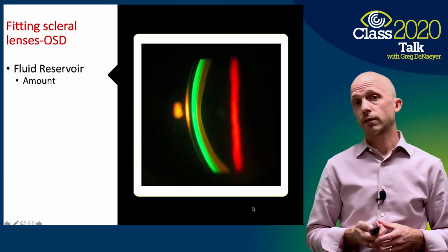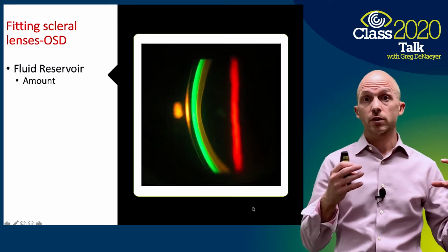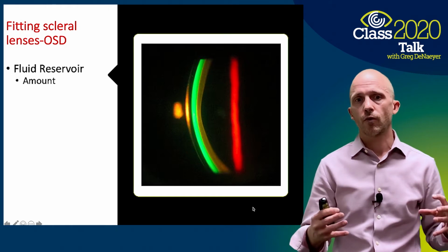And then what about the fluid reservoir? I think, again, our hypothesis might be for someone who is severely dry that more is better, so we want to give the patient more reservoir fluid.